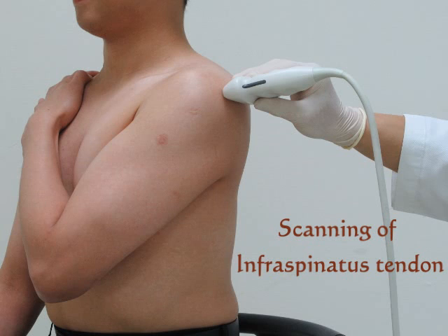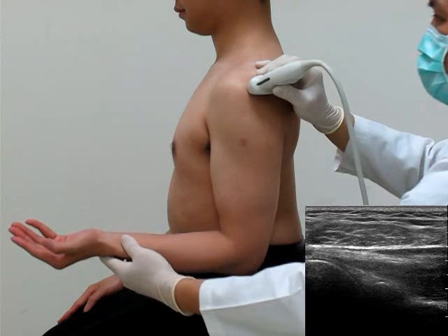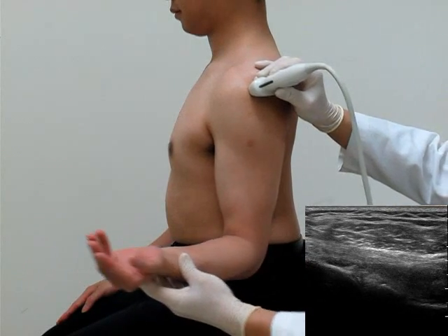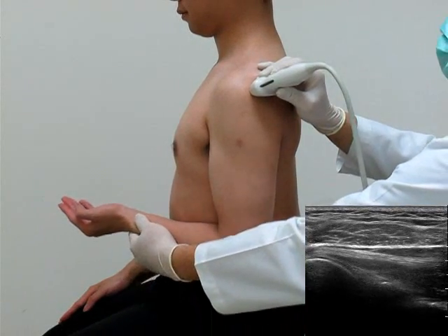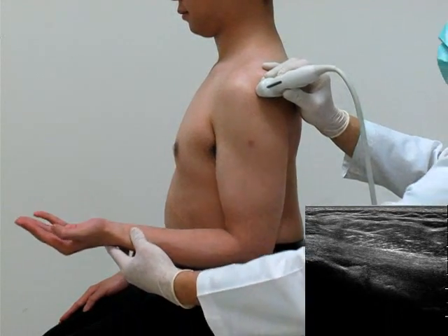Infraspinatus and teres minor tendons are examined at the same position, by putting the patient's arm across the chest with the hand on the opposite shoulder. The posterior cuff is examined by placing the transducer on the posterior lateral part of the shoulder. The infraspinatus tendon can be visualized inferior to the spine of the scapula. Dynamic study can be done with active or passive external-internal rotation of the patient's shoulder.